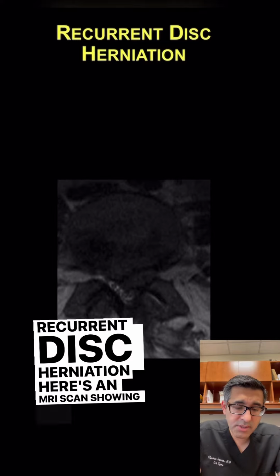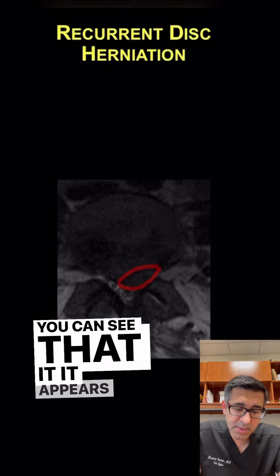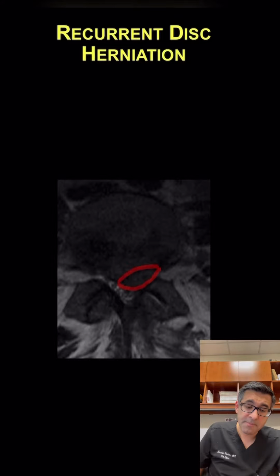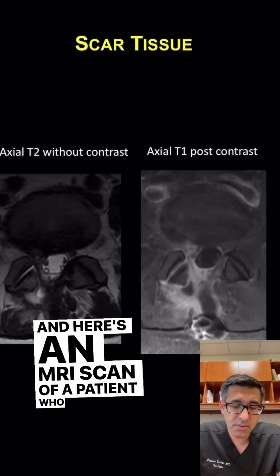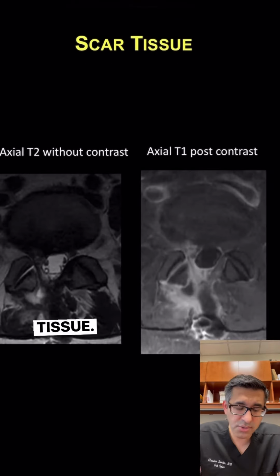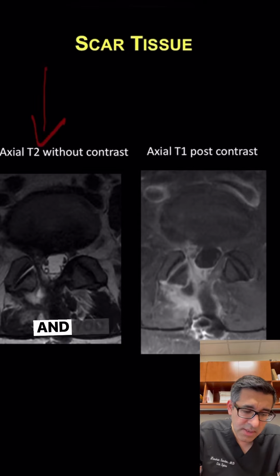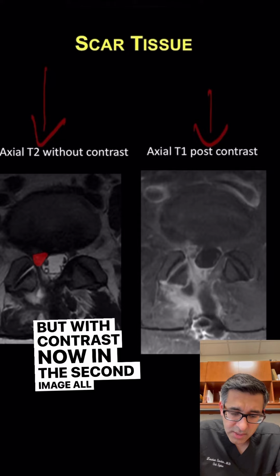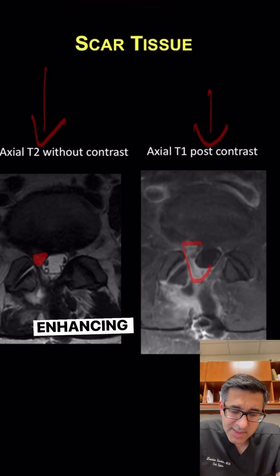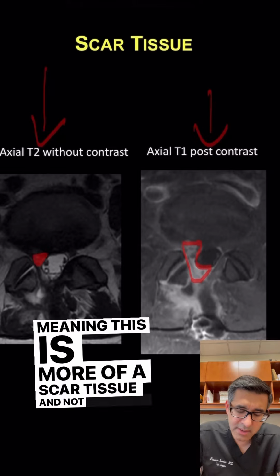Here's an MRI scan showing an example of a recurrent disc herniation right here. You can see that it appears dark on this MRI scan. And here's an MRI scan of a patient who has essentially scar tissue. So you can see here, this is the image before contrast. And you see it looks like a disc bulge, maybe something going on here. But with contrast now in the second image, all this is still enhancing with the contrast, meaning this is more of a scar tissue and not a recurrent disc herniation.